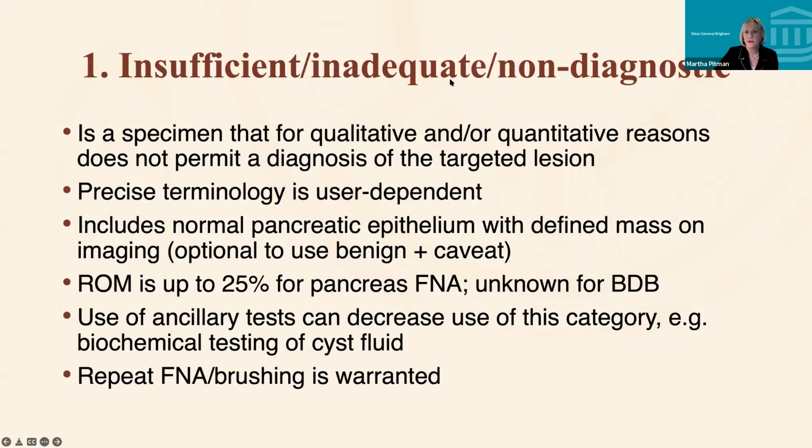Inadequate can be the same thing. You don't have enough cells to make a diagnosis. Insufficient means the same thing. Preferably, I use non-diagnostic, but you can use something else. But what it means is it's a specimen that for qualitative or quantitative reasons does not permit a diagnosis of a targeted lesion. It includes normal pancreatic epithelium with a defined mass on imaging. So for example, a well-defined, well-circumscribed, clearly visible image on ultrasound, and all you get is normal benign pancreatic tissue. That's non-diagnostic, even though you have slides full of cells.